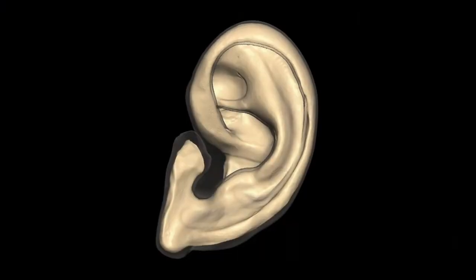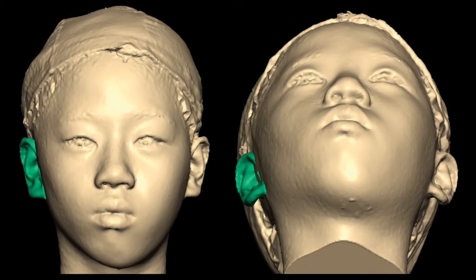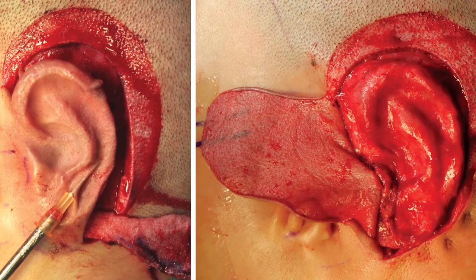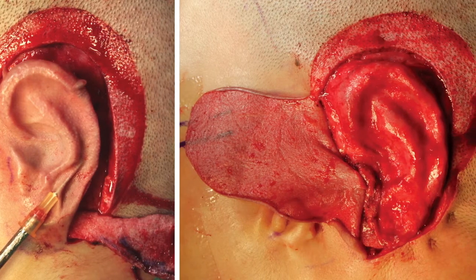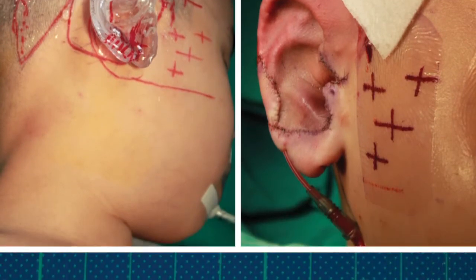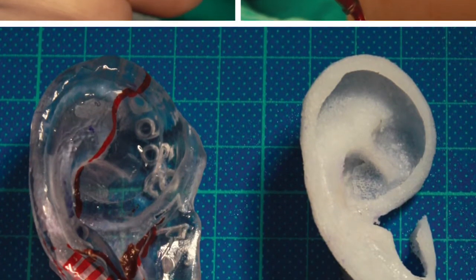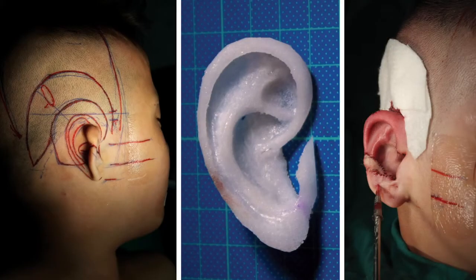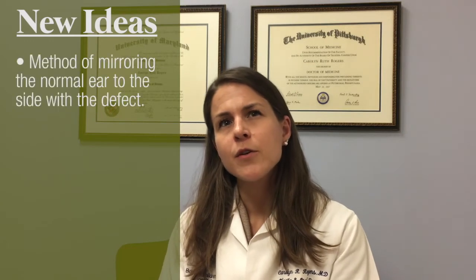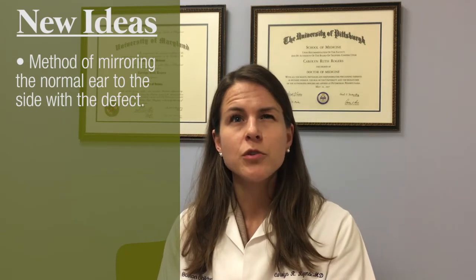What they do is use a 3D photograph of the child's normal ear to mirror that ear onto the opposite side to best determine the size, shape, and position of the new ear. From there, they digitally subtract the skin in order to create a template that is 3D printed and then used at the time of the operation. That template is used to confirm the position of the new ear on the child's head, and then the surgeon uses it during the operation as a guide to carve a block of porous polyethylene into a shape that best recreates that specific child's ear. One of the most novel ideas presented in this research is the method of mirroring the shape and position of the normal ear onto the side that's missing an ear, in order to create the most symmetrical new ear possible.